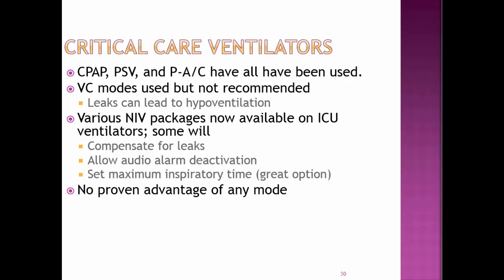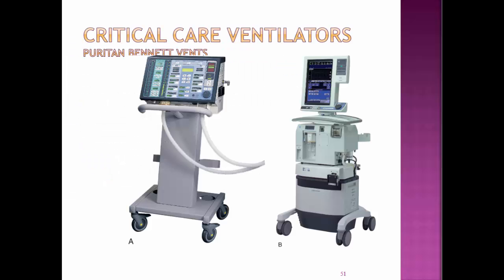No proven advantages for any mode. These are but a couple of examples of critical care ventilators that offer a BiPAP option. On the left you have a Puritan Bennett 760, and of course on the right a Puritan Bennett 840, much like what we have in the lab.